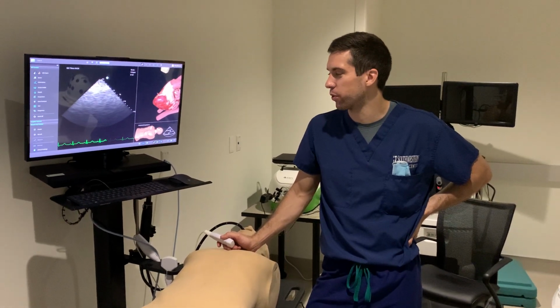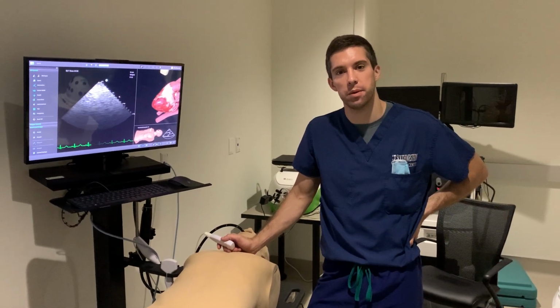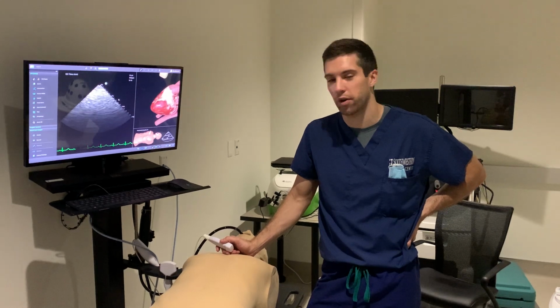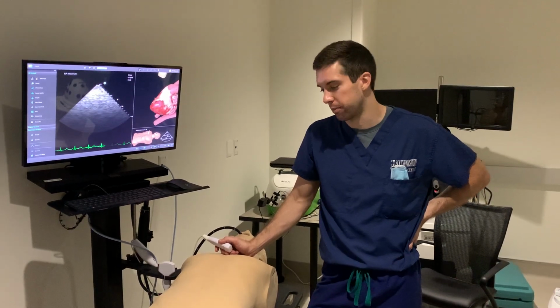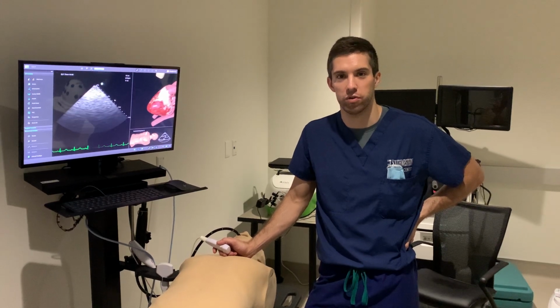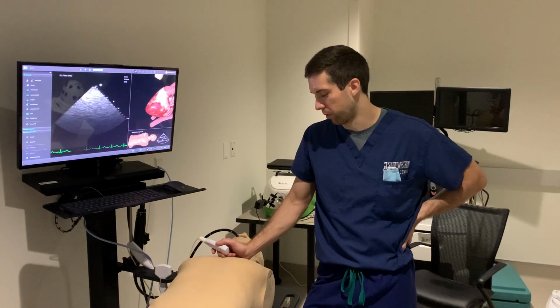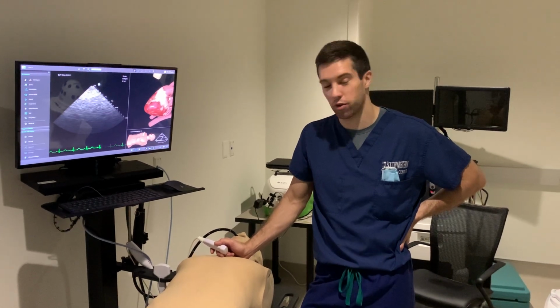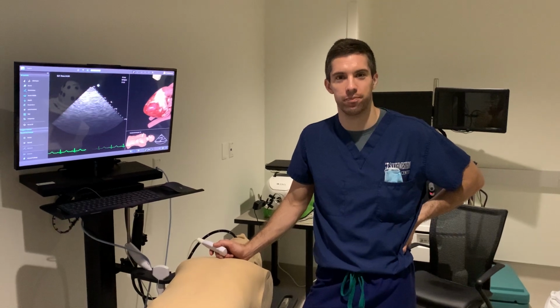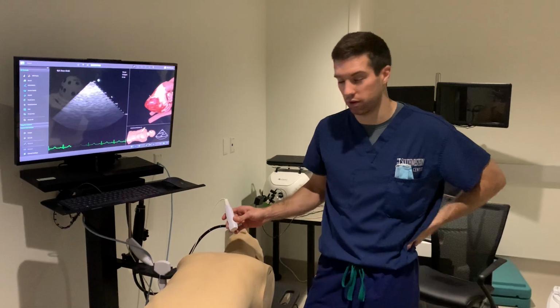Today we're going to go through just demonstrating keys to image acquisition of a point of care ultrasound of the heart. We're going to use this dummy here, and I'll just walk you through some of the basic views and how to optimize them for whatever you need to do. And Spencer will ask me questions as we go. Okay, so we're going to start in the parasternal long axis.